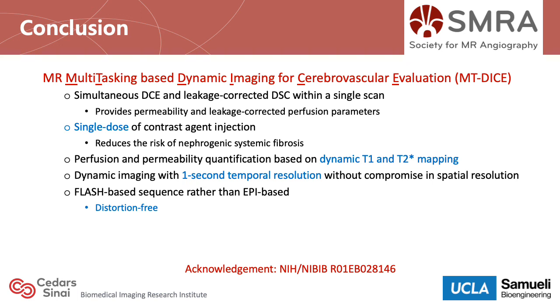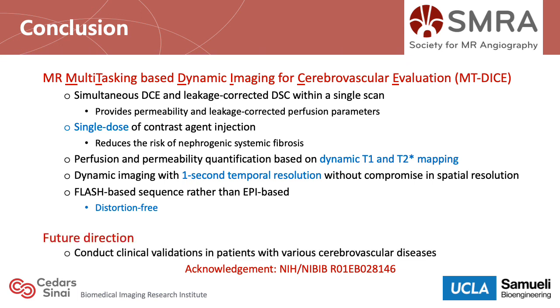Also, our technique can achieve a 1-second temporal resolution without compromise in spatial resolution. Moreover, our sequence is a FLASH-based sequence rather than EPI-based, so it does not suffer from distortion artifacts. Our future direction includes further conducting clinical validations of this technique in different types of cerebrovascular diseases.